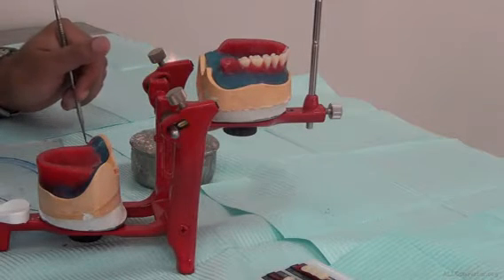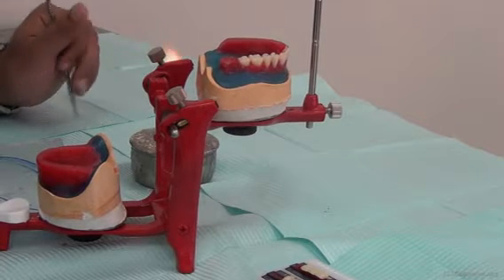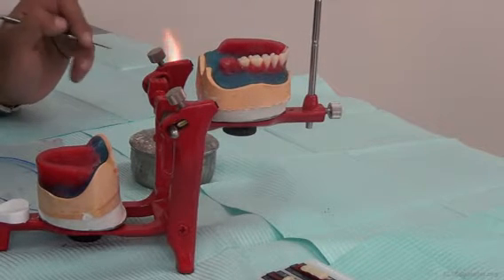Assalamu alaikum. Today we're going to talk about setting of the lower anterior teeth in this video, and the video later will be talking about setting posterior teeth.